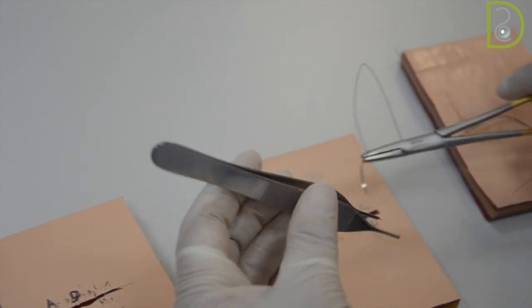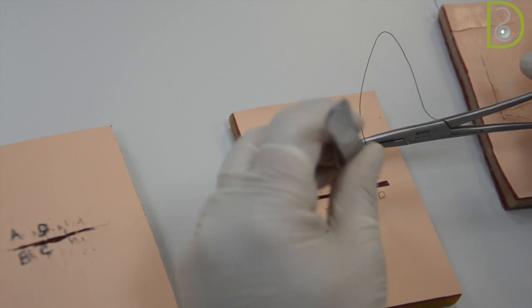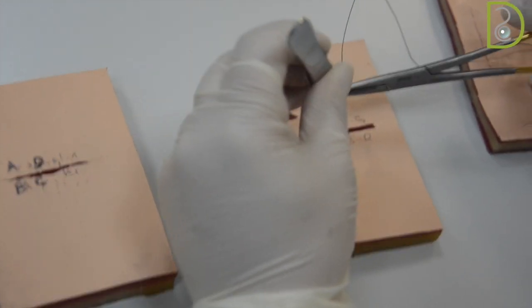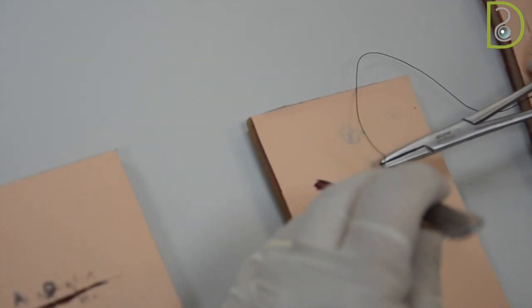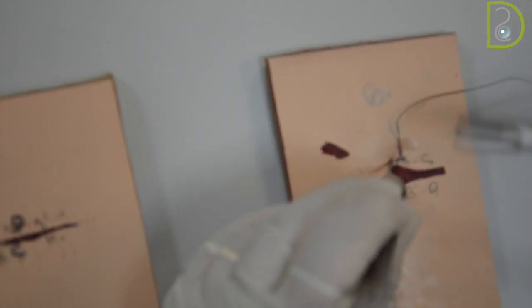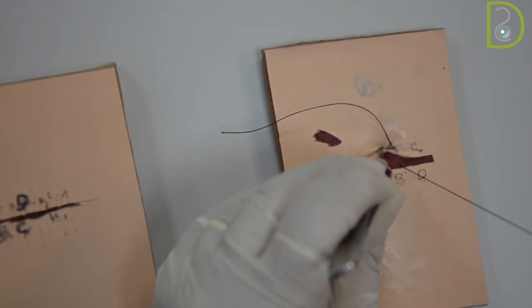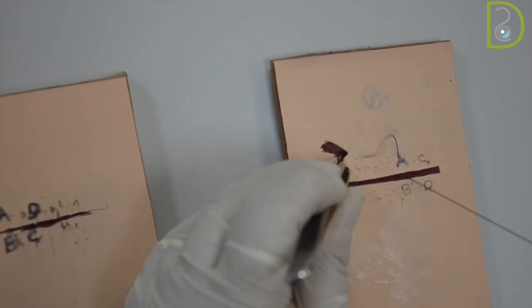Now we will start going from point A to point B. If you want to consider it as a buccal surface, go this way and hold the tissue going through the socket — that is in two steps if you want.